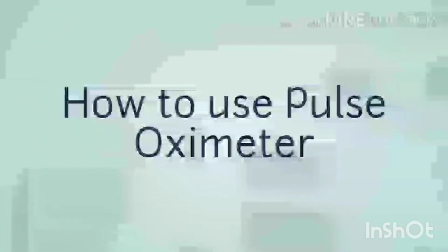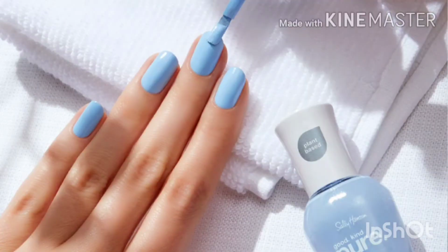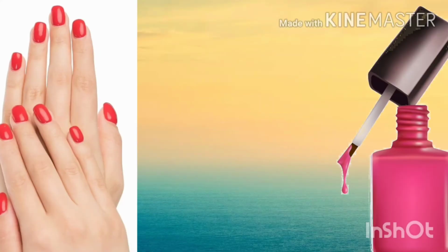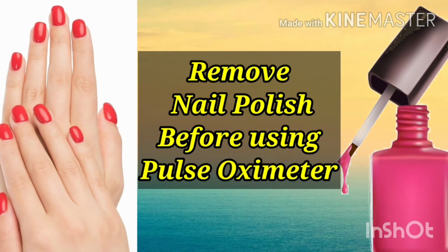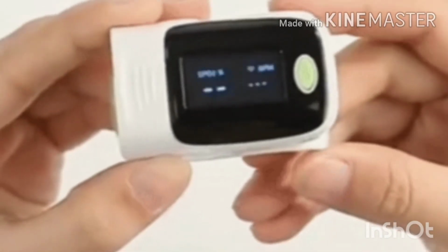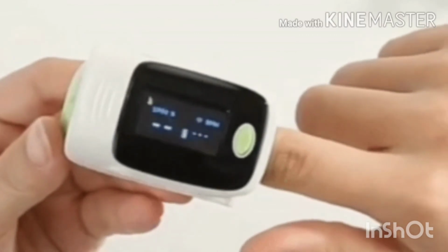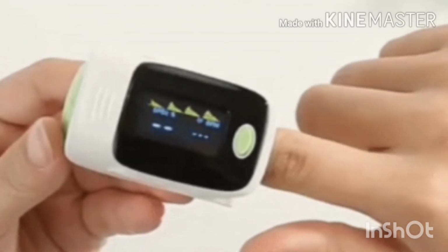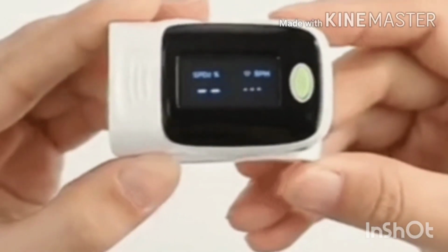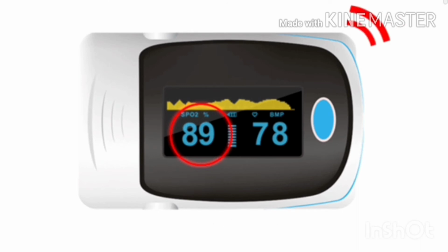First of all, before using the pulse oximeter, we should wash our hands, and if any nail polish is there, it is better to remove the nail polish, because placing the pulse oximeter on the nail polish may vary the results. So, remove the nail polish and measure the oxygen saturation. Select a finger. Generally, the index finger or middle finger can be used. Place the pulse oximeter probe on the finger and turn on the device, and watch out for a beep sound.